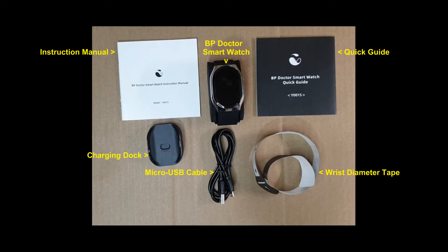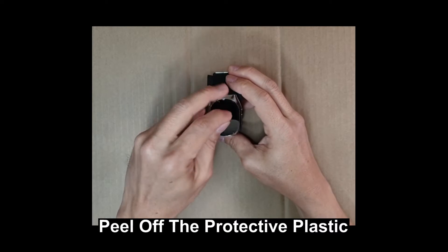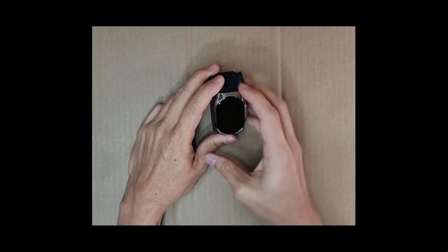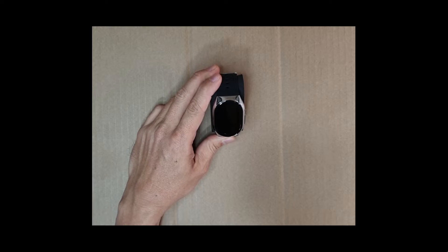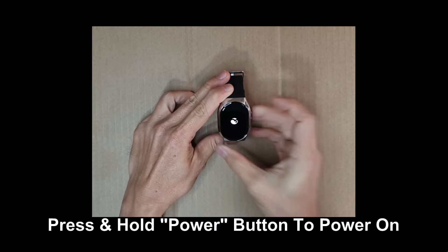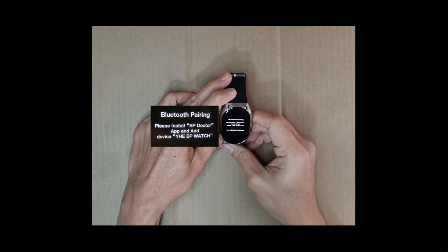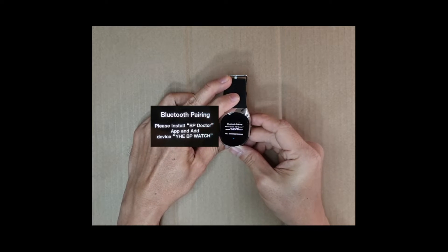These are the items in the box. Let's take a look at the watch. This is the power button and this is the home button. Let's press and hold the power button to turn it on. We need to install the BP Doctor app and add the device YHE BP watch, so let's do that on our mobile phone.